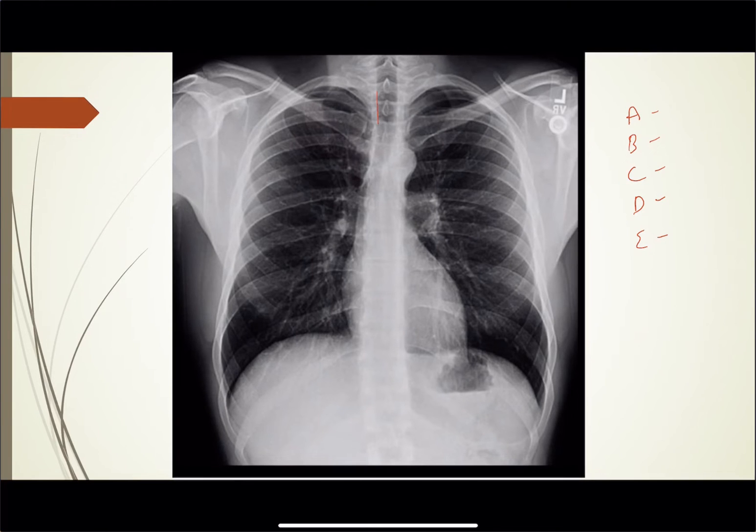A for airway: you can see the trachea coming down. On either side this one is easy to pick out — the carina is right there. Some films it's a little more difficult and I'll show you a way to figure out the level of the carina in that case.